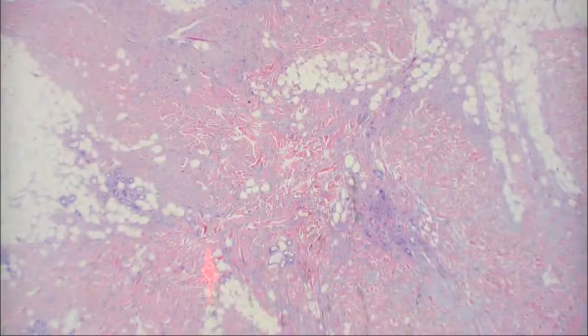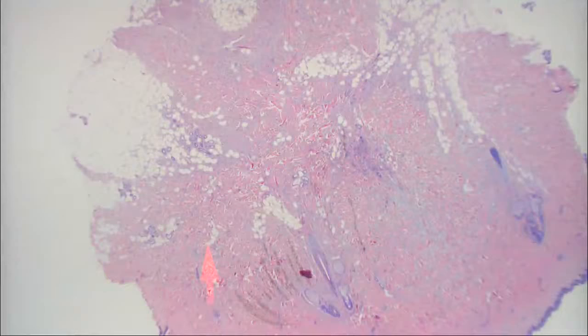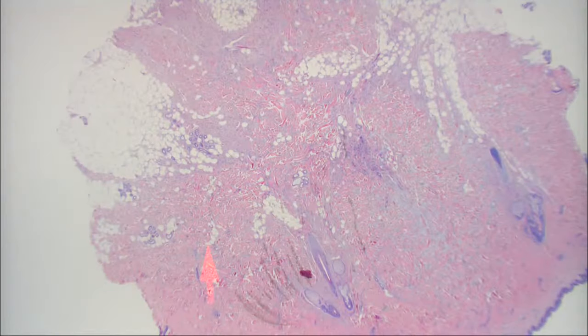It was interesting. Last one. And so here we have a punch biopsy of non-acral skin. Do you think it was inflammatory or neoplastic? Inflammatory. Okay, what pattern?